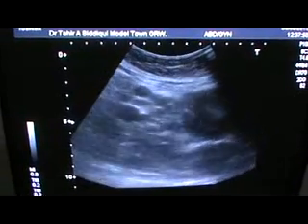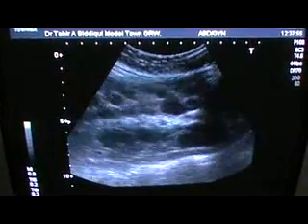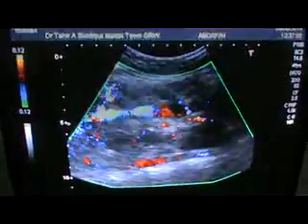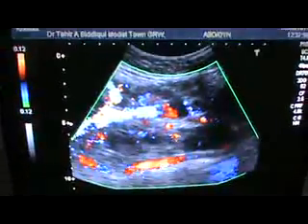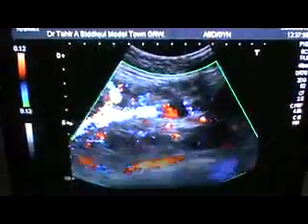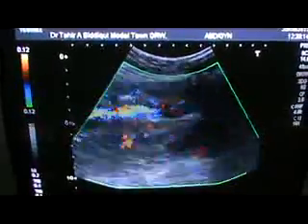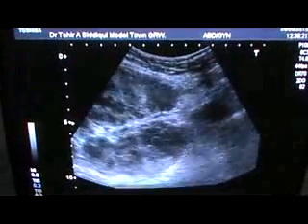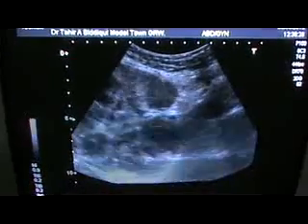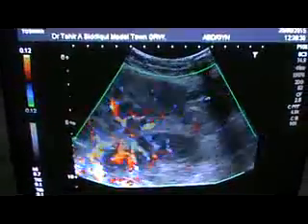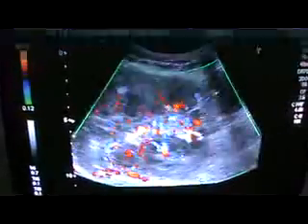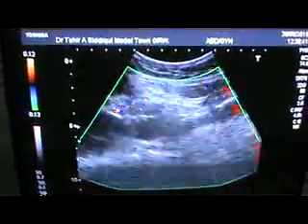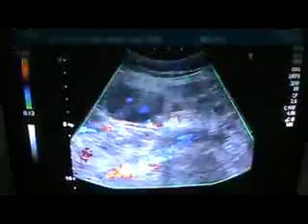Here is where the mass starts. It is a para-aortic mass. This is the aorta in front of you, and the rest of this is the mass. It is a para-aortic mass extending downwards, involving all of the left side of the abdomen. You can see the vascularity of the mass. As I come down, the mass is still there. These are the left iliac vessels — you can see the iliac vessels are being encased by the mass.